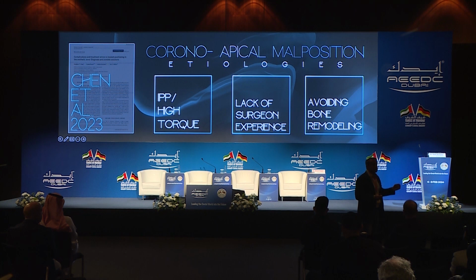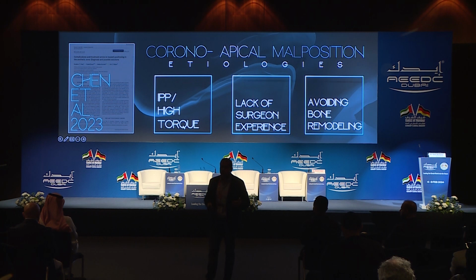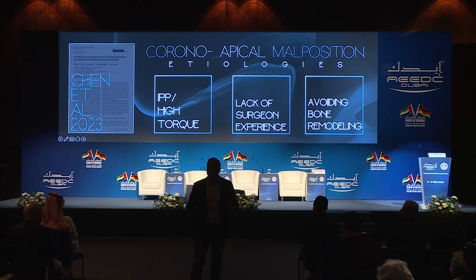Like Nilesh said, implant placement is a surgical procedure driven by the prosthesis. Where is your future prosthesis going to be? This is where you're supposed to place your implant. 3 to 4 millimeters from your future gingival margin, done. If there's bone, fine. If there's no bone, you have to graft the bone. When I was a student, they used to teach me, place the implant where the bone is. No, wrong. We have to place the implant where the final prosthesis will come.